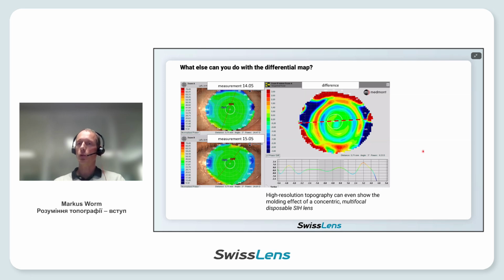Again, you just see the topography of a cornea, not over the lens. Here are the two images that were compared. And in the cross section, that's very important and interesting to see. You can see very well the wave going up and down with the power. You can see the line here. That's exactly what you're seeing here. And it might be a lens design, like in this picture, with different concentric zones for distance and near vision. Well, sure, not the best fitting in this case.